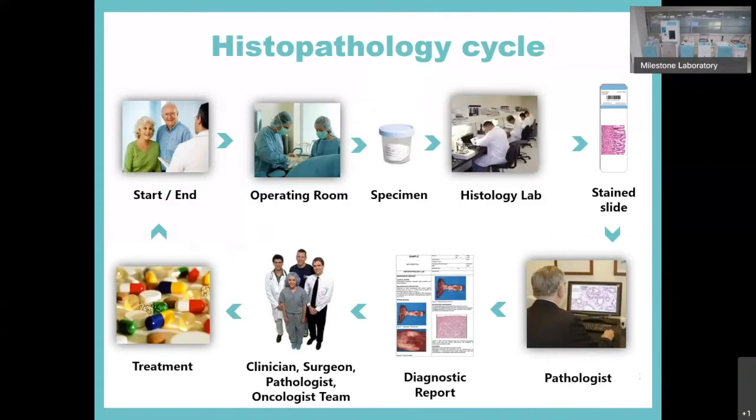I want to start, first of all, with this slide that is the histopathology cycle, where you can see that everything starts and ends with the patient. Why do I want to start with this slide? Because we must remember that the moment the specimen leaves the patient's body, the diagnostic path, and therefore the treatment, starts. So today in this webinar, ultimately, we are talking about delivering to the patient the best possible treatment.